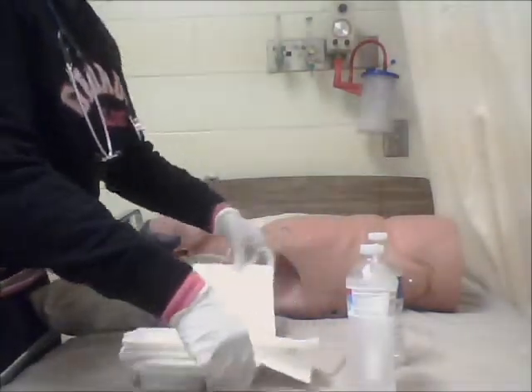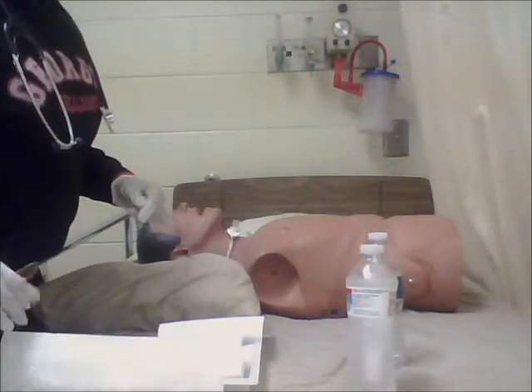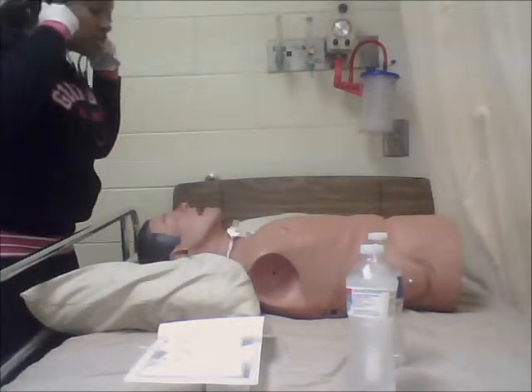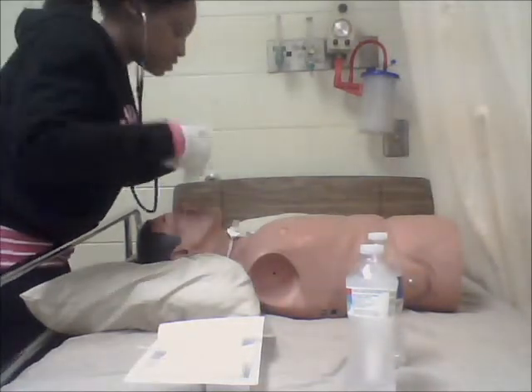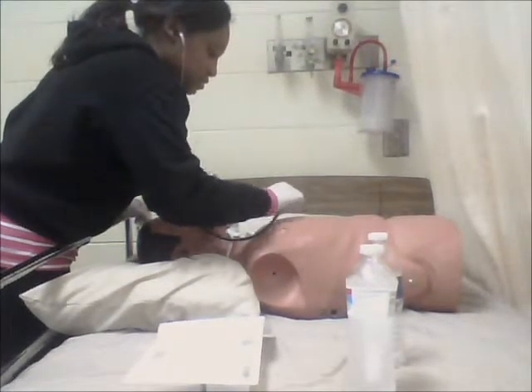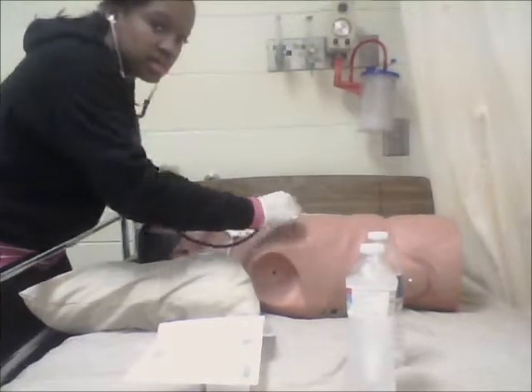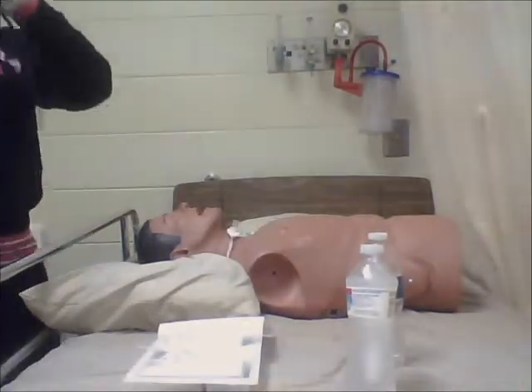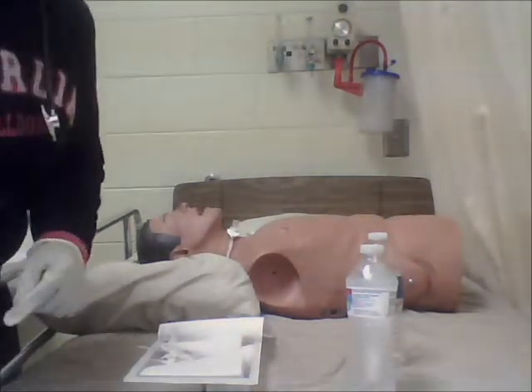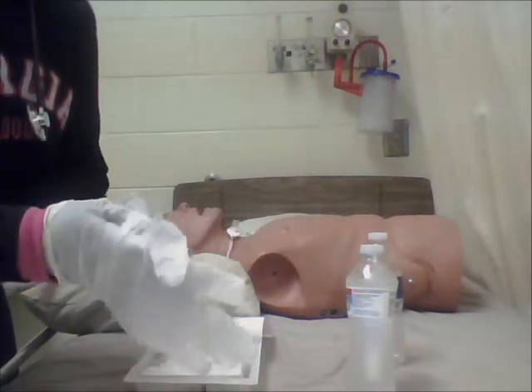Go ahead and open up my trach care kit. Go ahead and take my gloves out. Let me go ahead and auscultate and listen to the breath sounds on both sides. Okay, everything sounds good. Go ahead and put on my sterile gloves.